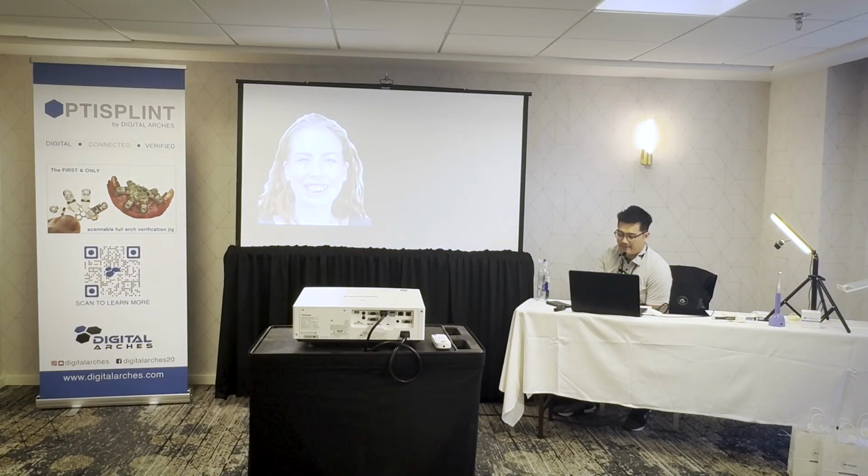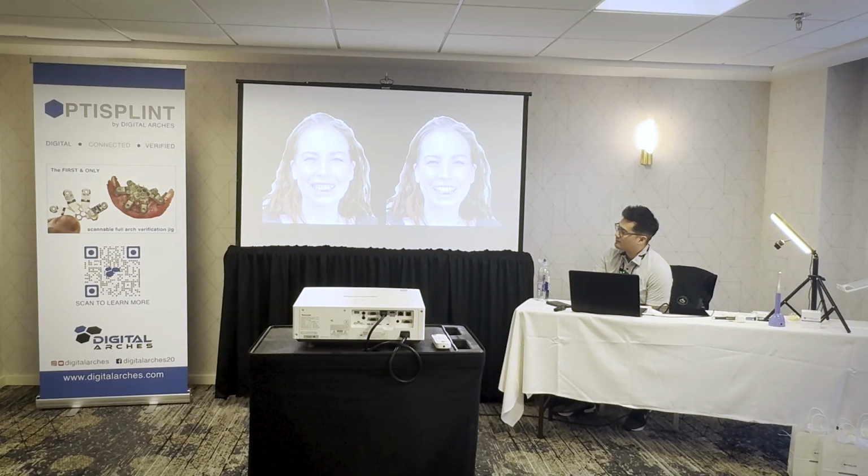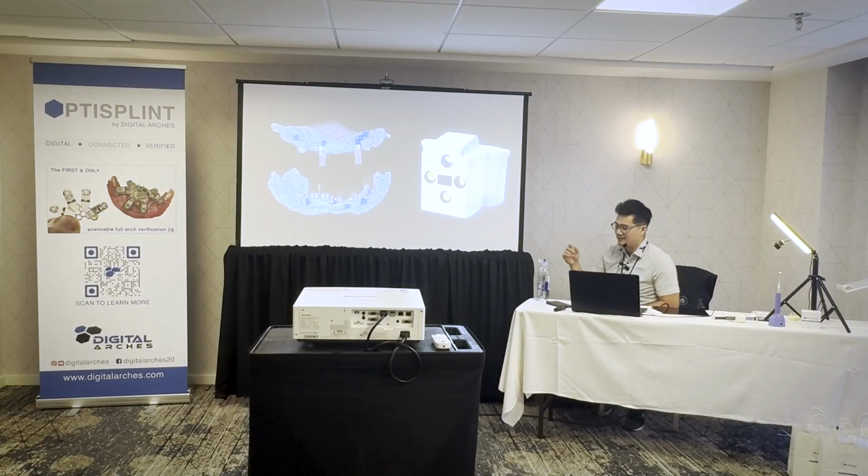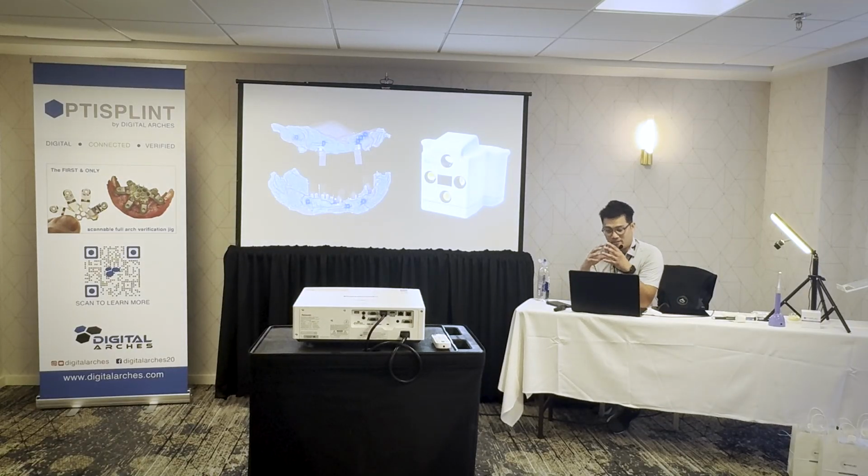And so we did a smile cloud. We do a 2D smile design because you have to reduce bone when you have that much excess maxillary tissue. That was our design. Then we used the BLC implant, and ICAM was going to be there. Straumann had a film crew fly in because they were going to film the whole thing and make it like a big commercial.